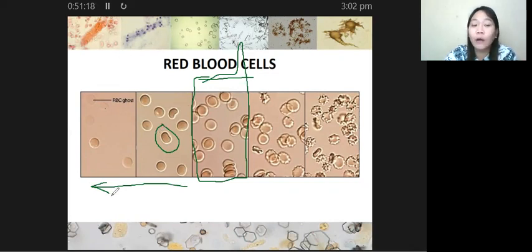If you allow this to persist, the lysis of your RBC will result in the release of your hemoglobin and the contents of your RBC, leaving now just your cell membrane, without the contents of your RBC. Kaya nagiging RBC ghost cell sila. Parang remnants yan ng RBC due to lysis in hypotonic urine.